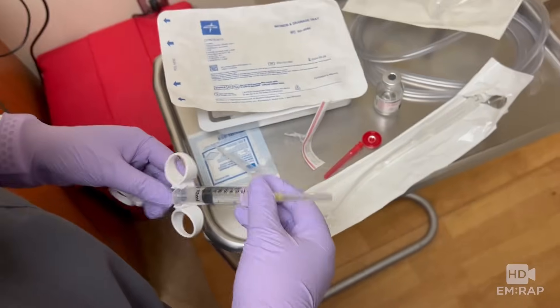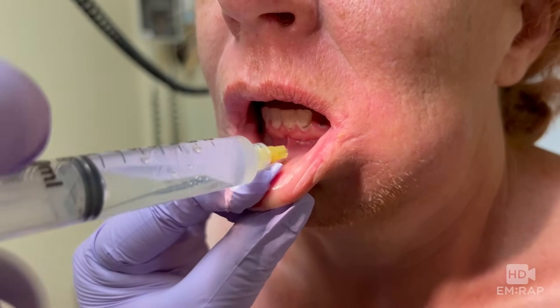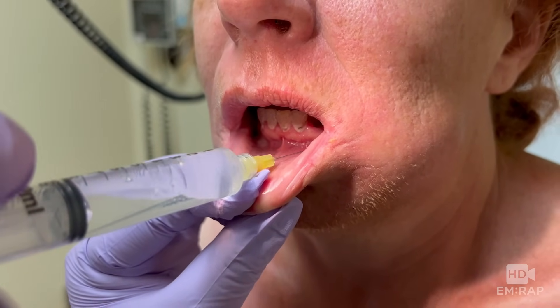Attach a 27-gauge needle, remove the gauze, and now provide a lidocaine injection over the area of the planned incision. An inferior alveolar nerve block is another option.